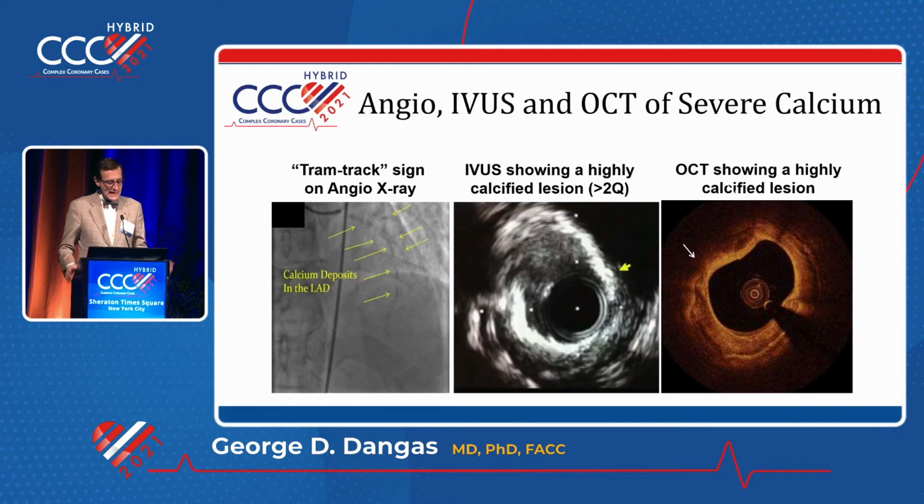And you can see an example of tram track calcifications. There is no dye in the left panel, but you can clearly see the outline of the vessels because there's tremendous calcium, tremendously dense calcium, as well as long calcium. In more sophisticated modalities using intravascular imaging, in the center, the classic intravascular ultrasound, whatever is bright white has a shadow behind it. You can't see really anything, is a typical calcium, very dense in this particular case.